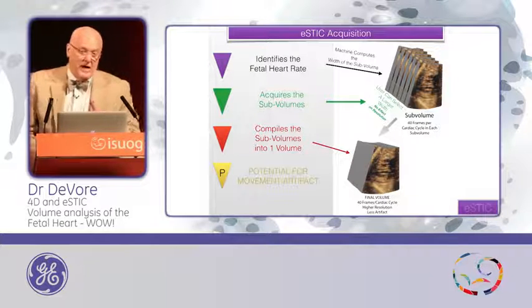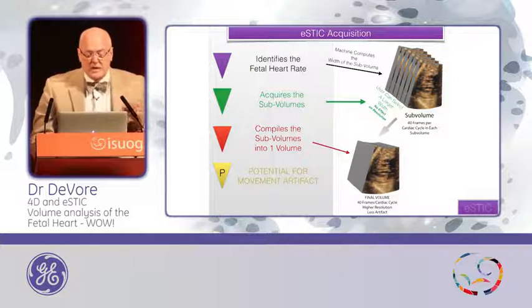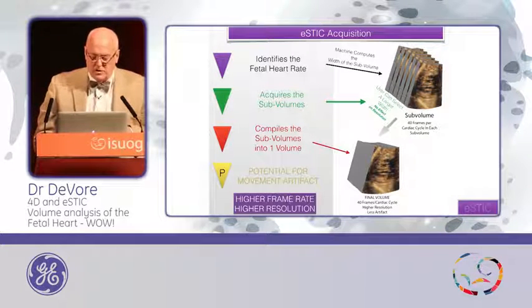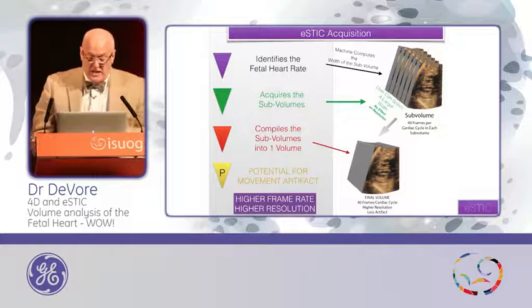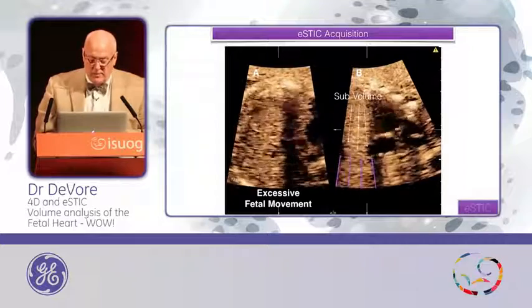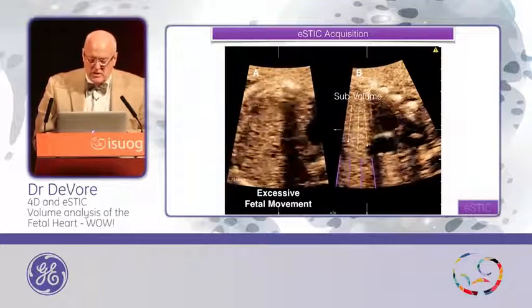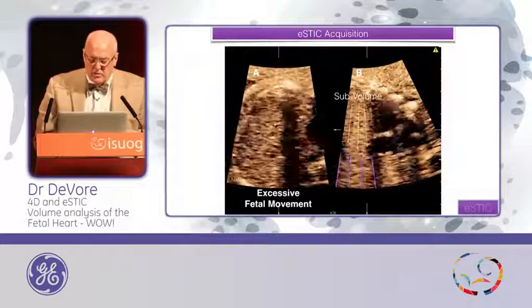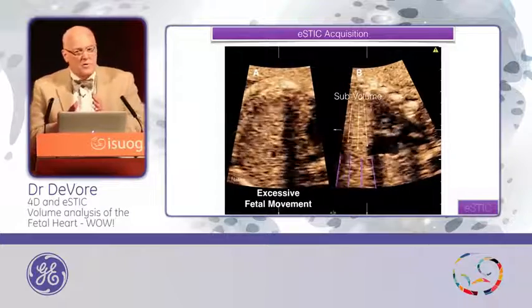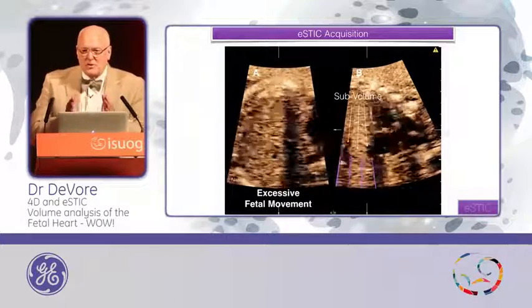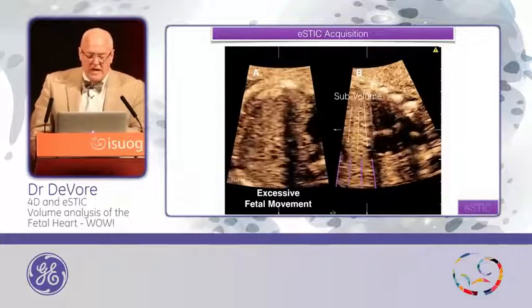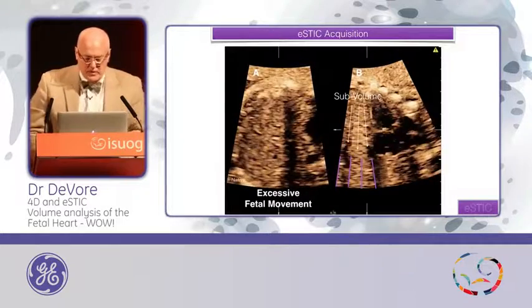There is a potential for artifact. If the fetus moves, the E-STIC — because it sweeps much faster and acquires more data than the mechanical STIC and has a higher frame rate — we still sometimes see this artifact. On the screen, you can see purple lines located here and here, which are the sub-volumes acquired. Because of movement, they jump out at you and show artifact. This is something we don't see very often, but that's what the sub-volumes look like when demonstrated.